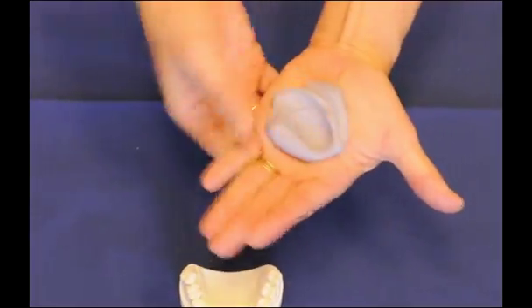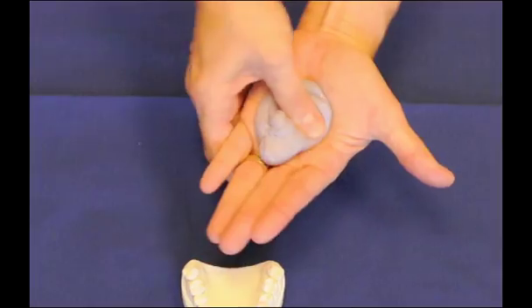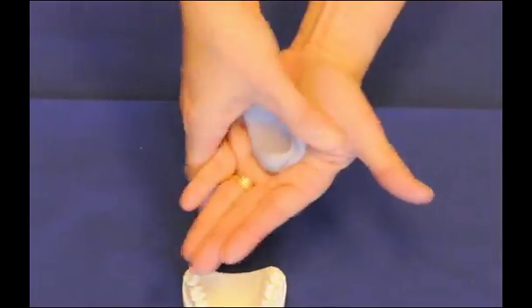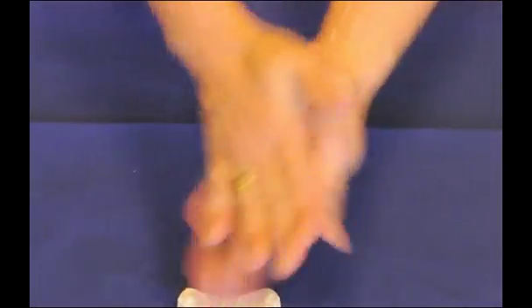Once I get the material completely incorporated, and I do have a uniform color, I'll then be able to form the material over the dental cast that I have in front of me.